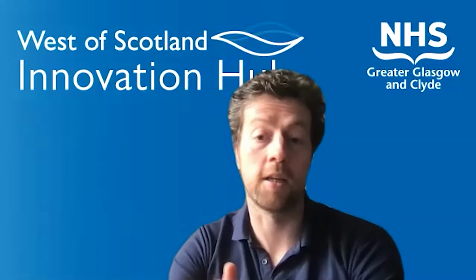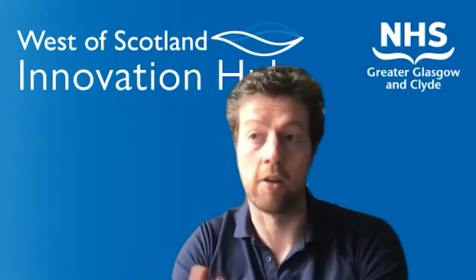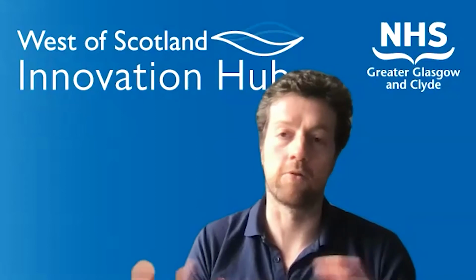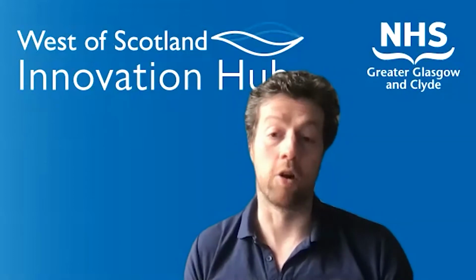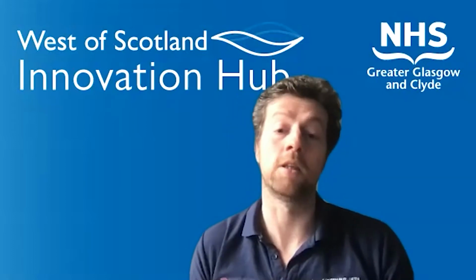I think there's significant demand on radiologists, and that continues to go up as we're starting to try and streamline processes. We're doing more early investigations, both for stroke and general presentations into the emergency department. And really what AI does is it's augmented insight, it's clinical decision support that allows triaging to surface and prioritize reporting. One of the main thrusts of the original iCAIRD work was around the idea that we do approximately 100,000 chest x-rays in Greater Glasgow and Clyde each year. We're the largest health board in Europe, of which about 30% of them are entirely normal. And if AI with confidence can strip those out so they don't need to be reported.